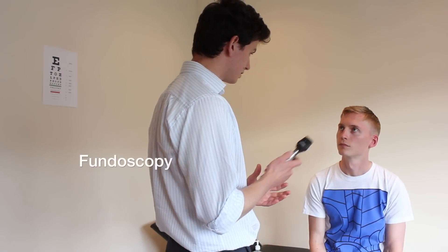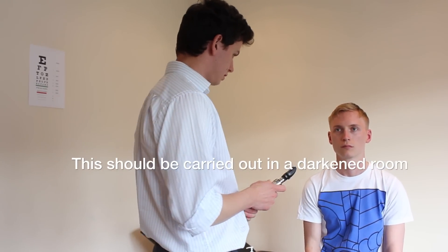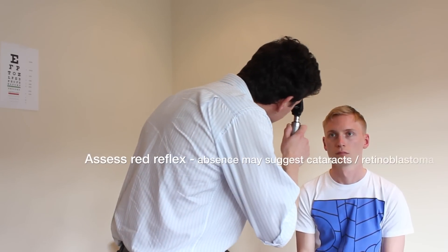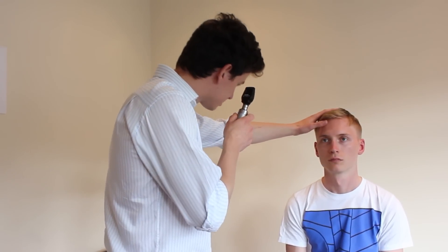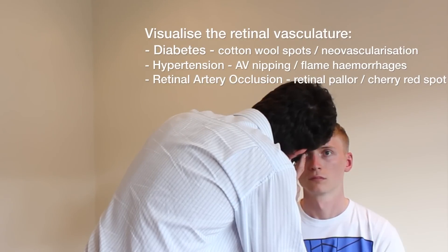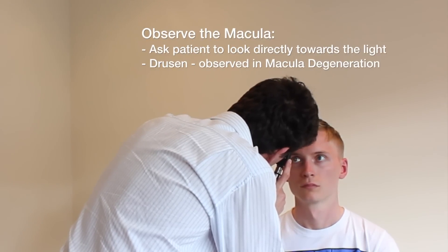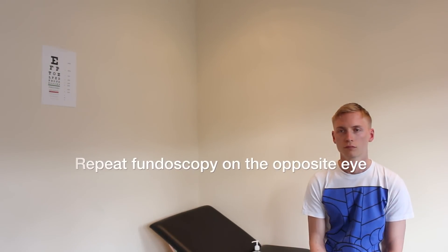I'm going to have a look at the back of your eyes now with this instrument here. It's going to involve me shining bright light into your eyes so it might be a little bit uncomfortable. So if you can just look ahead at the spot in front of the wall. I'm going to place my hand onto your head now, so if you just stay looking straight ahead. I'm just going to come up quite close.